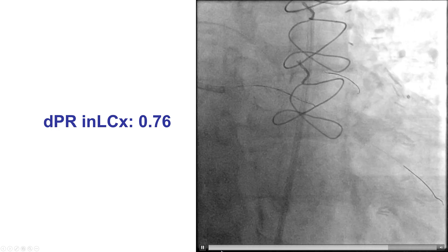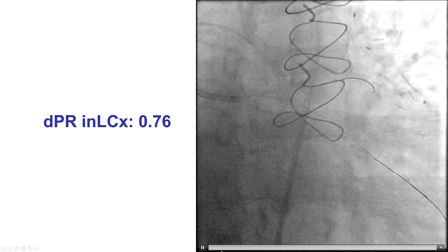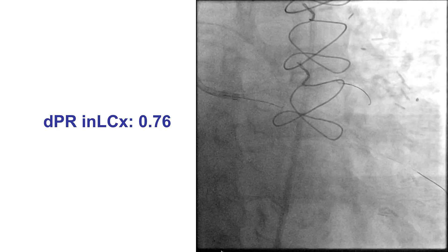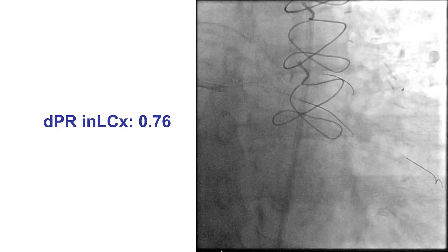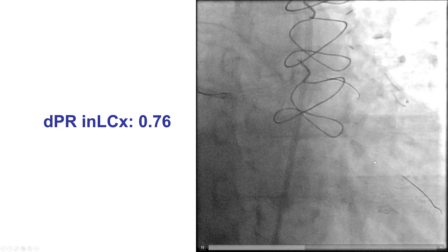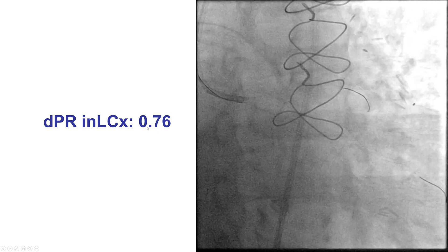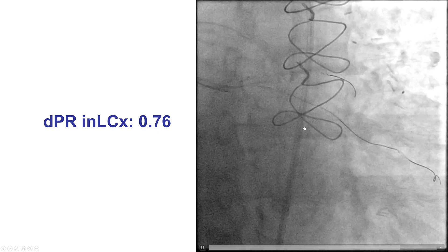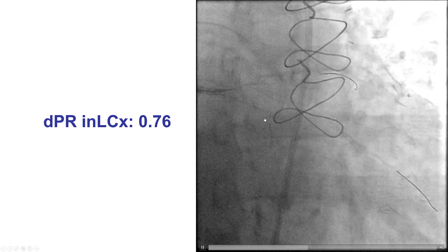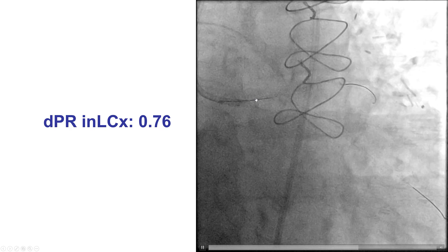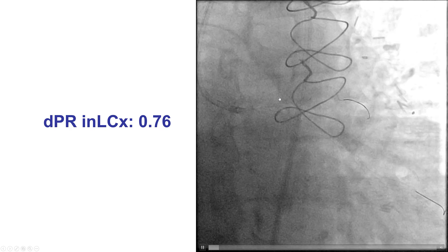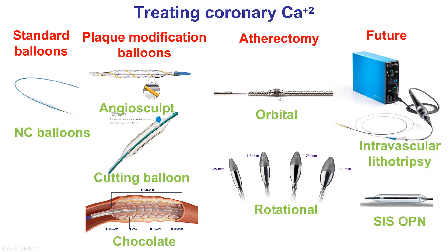We did a physiologic assessment to see whether our balloon inflations were good enough. However, the dPR on the obtuse marginal branch was 0.76, with the step-up being right at the proximal circumflex. Therefore, we clearly had residual disease in the proximal circumflex.